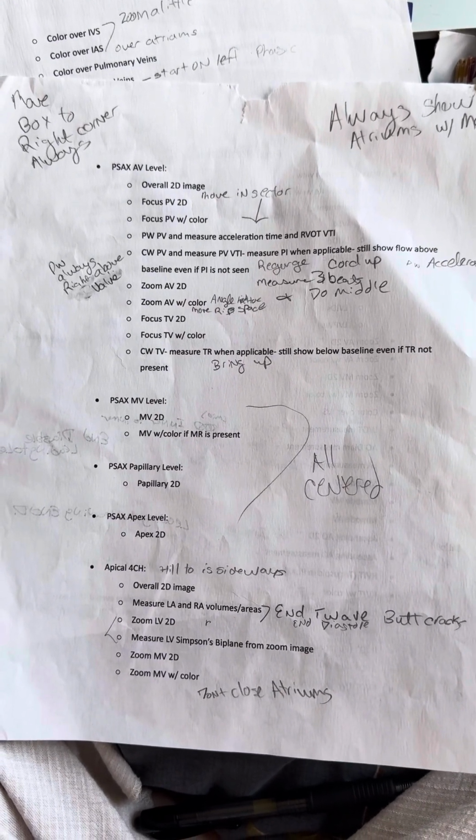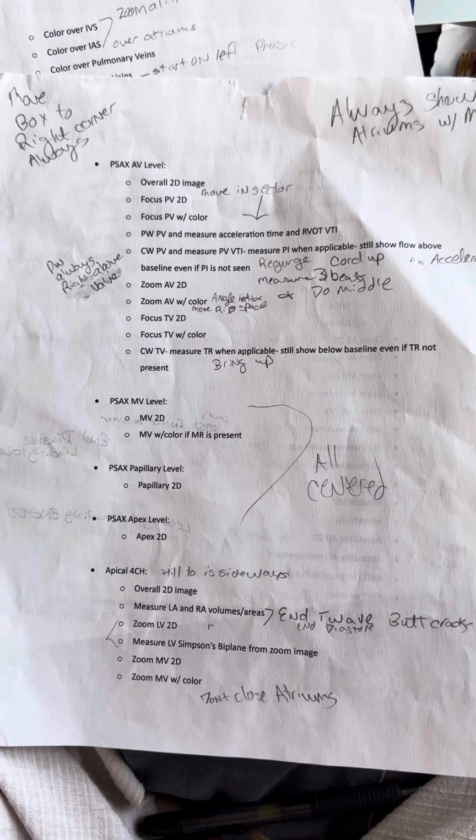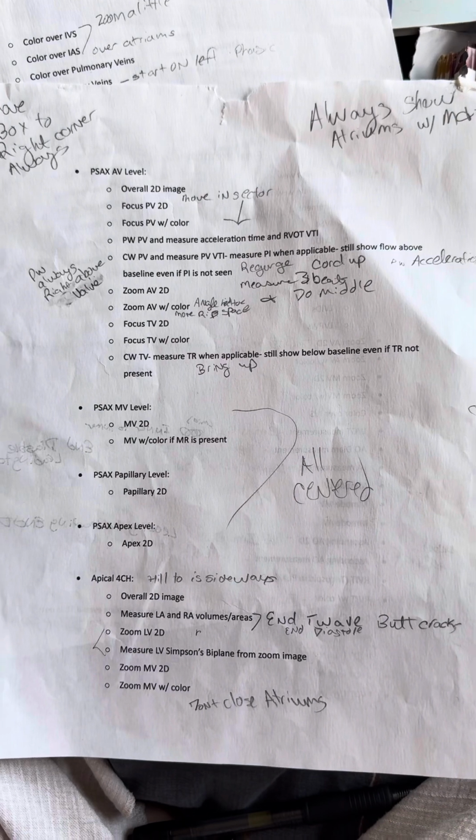And then you will do pulse wave through your pulmonary valve and measure acceleration time and the RVOT VTI. Next, color or continuous wave through the PV and measure PV VTI.